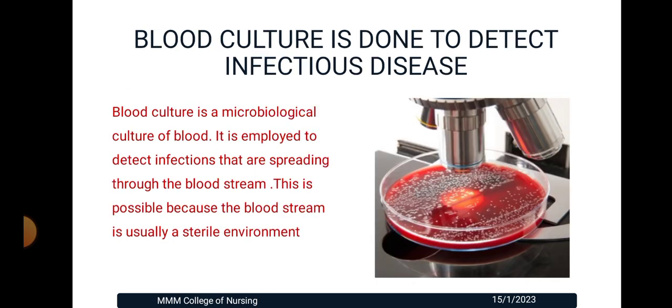Blood culture is done to detect infectious disease. Blood culture is a microbiological culture of blood. It is employed to detect infections that are spreading through the bloodstream. This is possible because the bloodstream is usually a sterile environment.